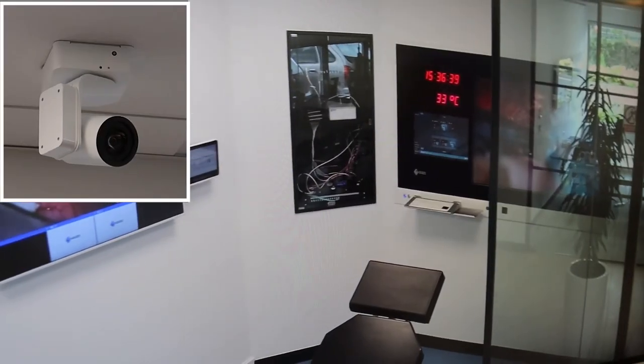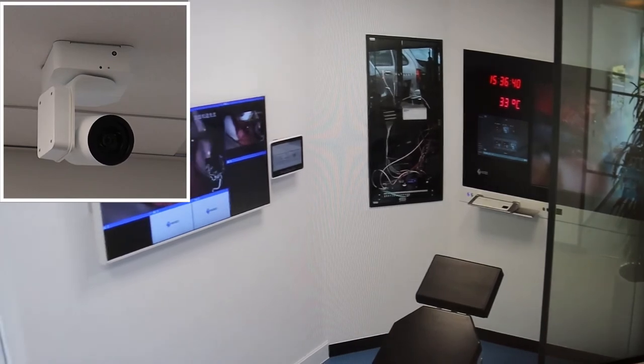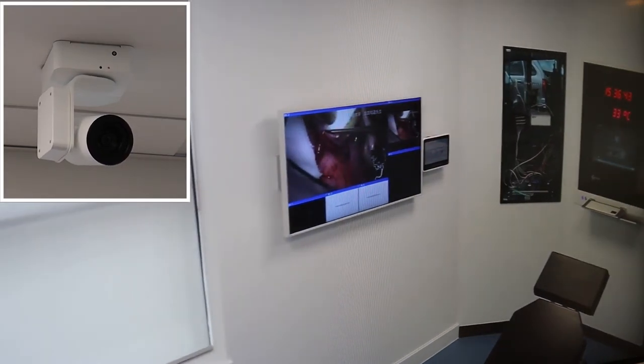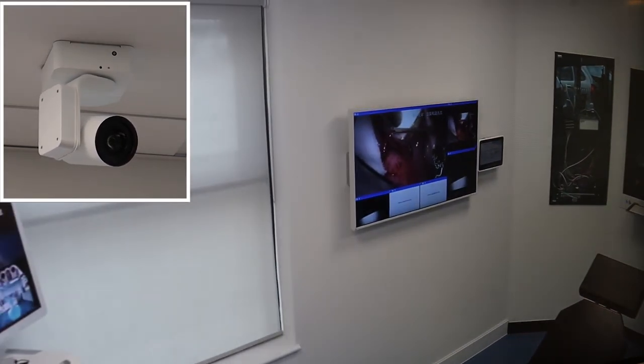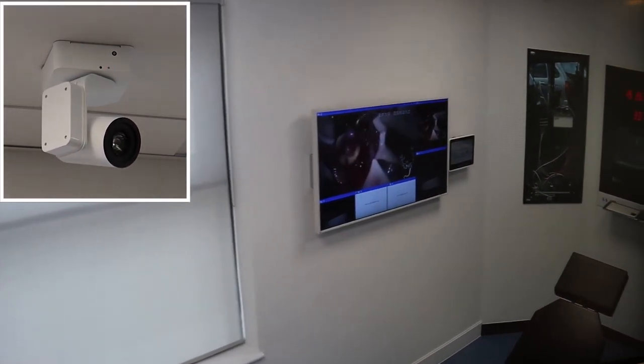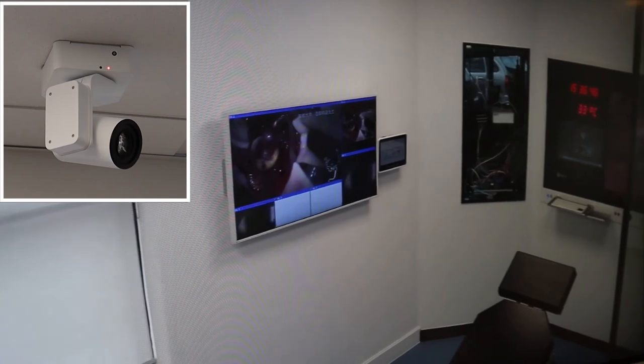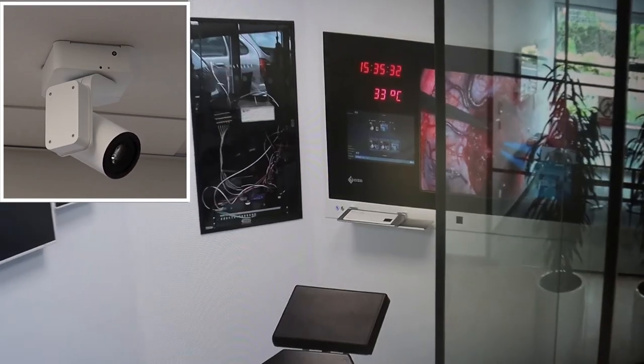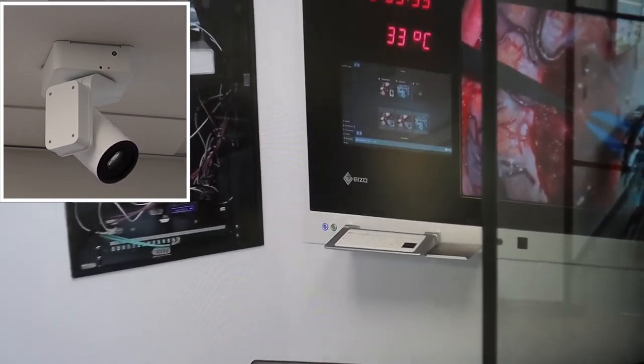This is our Creator PTRZ Surgical View camera. With 4K resolution, 30x optical zoom and integrated tri-axle camera mount, this allows for high definition and intuitive capture of surgical proceedings.